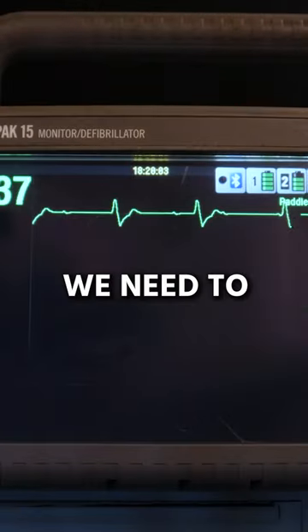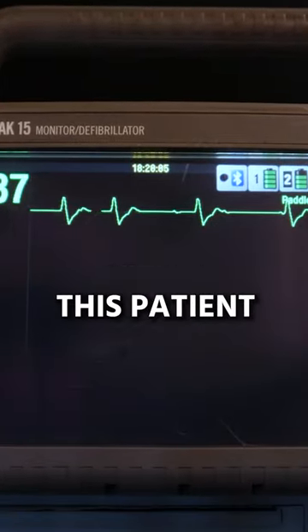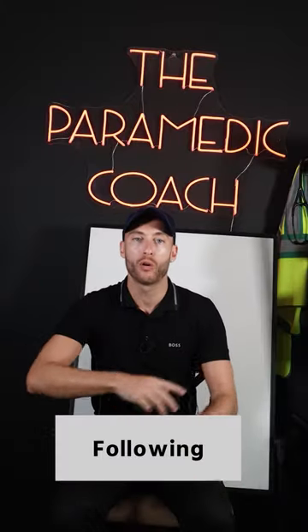This is a lethal rhythm. And the next step to this is going to be cardiac arrest. We need to pace this patient with the monitor. Follow my page here. I go over all of it.